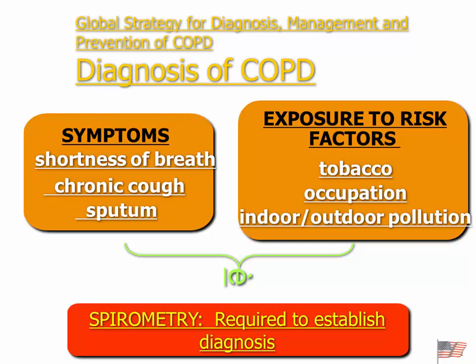And again, we think of it primarily as being caused by tobacco smoke. Recognize that it could also be either indoor or outdoor pollution. There's a high incidence of this problem in third world nations where they cook inside and don't have proper venting. You end up having COPD developing. But again, key part, we need to do spirometry. We can't diagnose it just by looks.